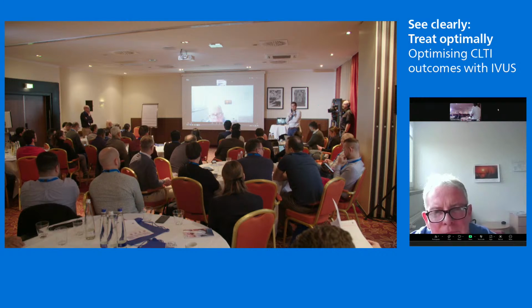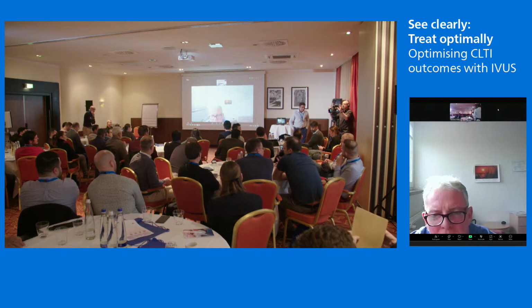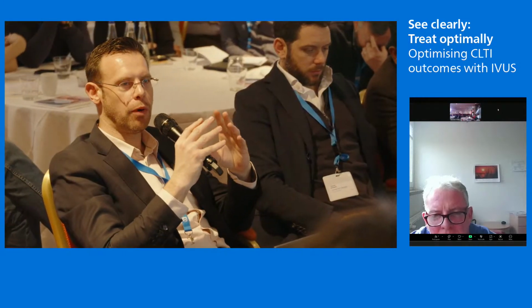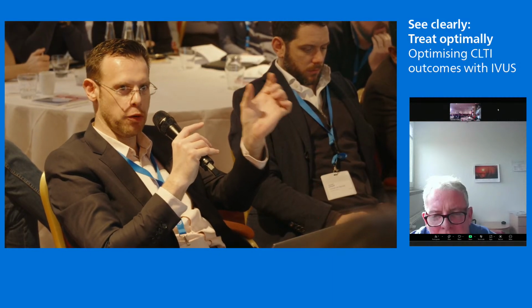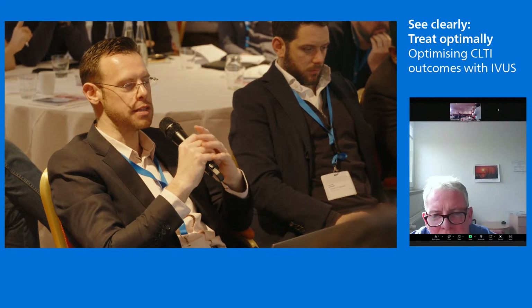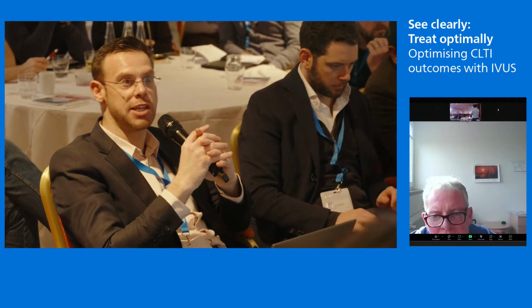How about Rotarex? Do you find the Rotarex tracks all right up and over? So it's all to do with the iliac bifurcation angle. Typically what we look for is distance. They talk about 4 centimeters being the crucial distance. But that said, I've not had too much trouble with it until I did.